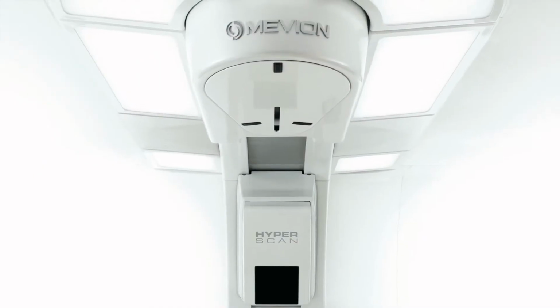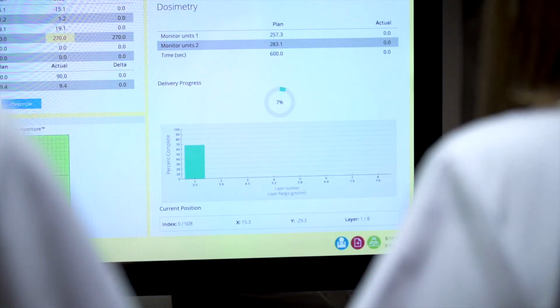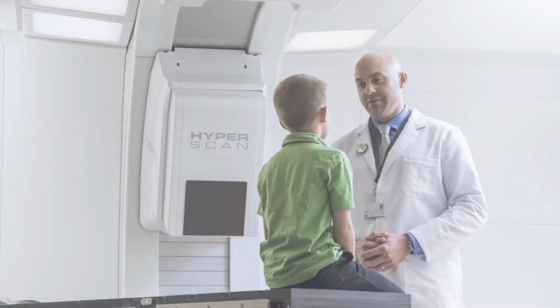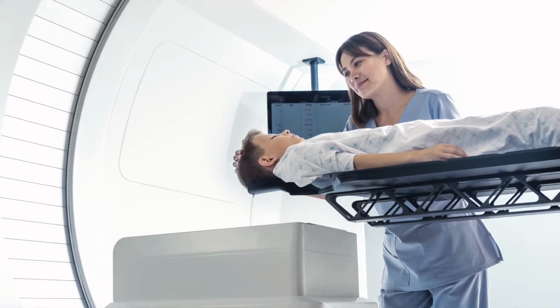Here at the Proton Center, we're really interested in looking at potentially changing the radiation plan every day for patients as their tumor shrinks, as their normal anatomy changes. That's called adaptive radiation. My own research looks at how radiation affects the pediatric brain. Radiation is still really important for curing many malignant brain tumors, but it's important for us to understand the side effects that it causes and the late effects for children. Proton therapy, decreasing radiation to normal tissues, is really important for children with cancer.